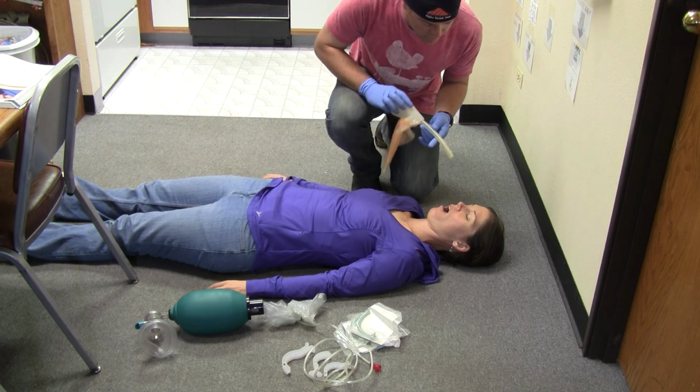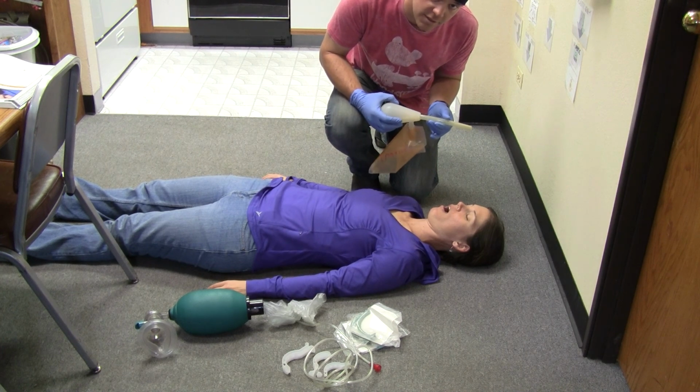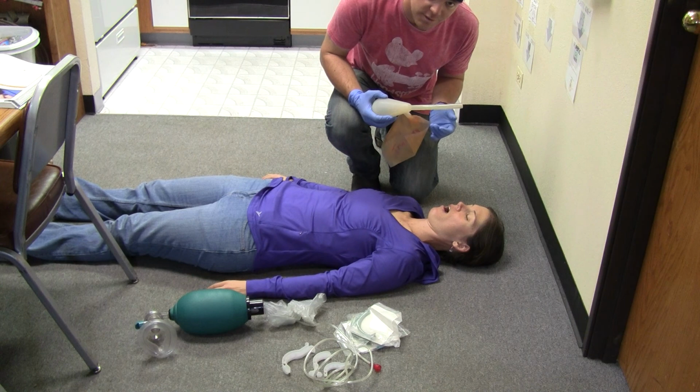And that's how you're going to do that. Most books say that you're supposed to do it for 10 or 15 seconds. Do it for as long as you need to get the airway clear.